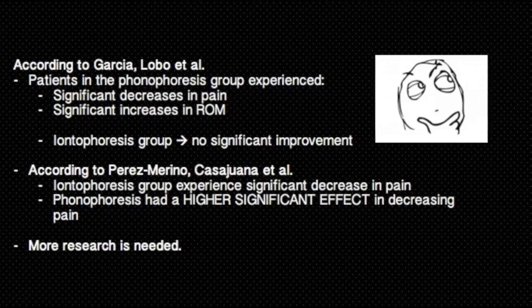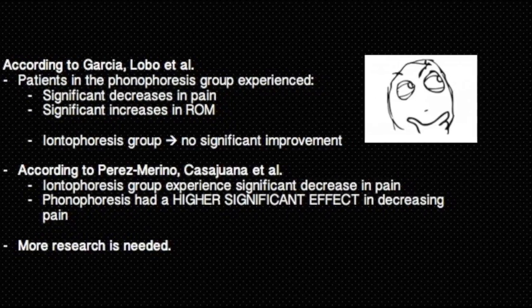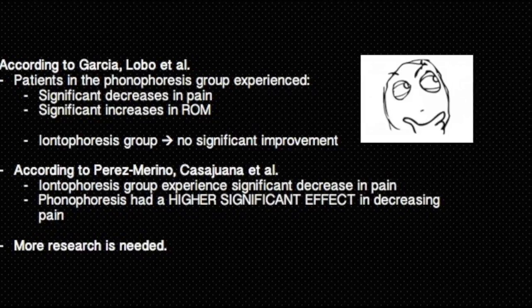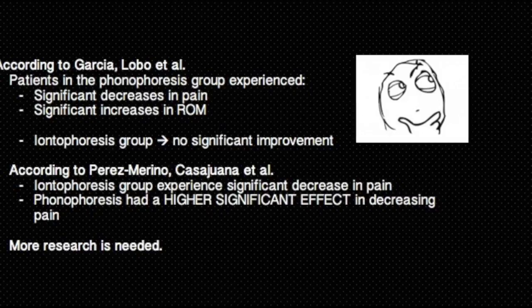Despite the conflicting conclusion on the effects of iontophoresis, both studies concluded that phonophoresis had a higher significant effect in decreasing pain on patients with shoulder impingement syndrome.